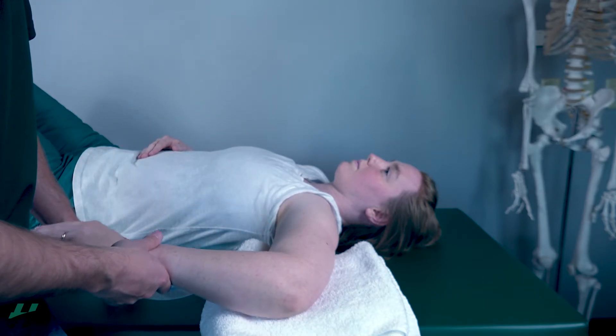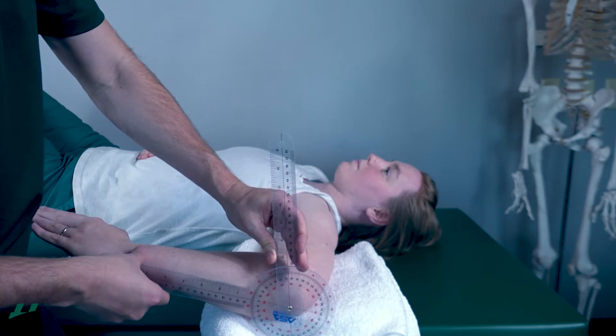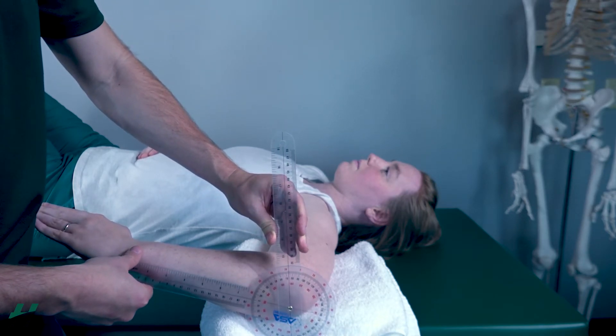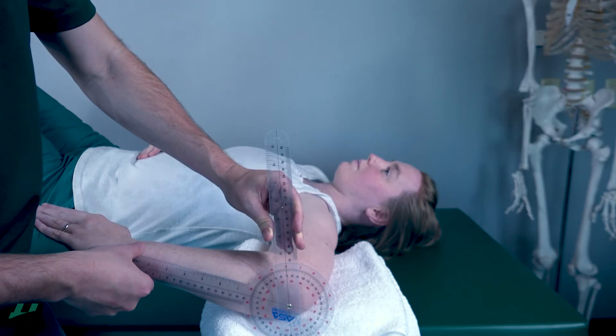So about right there. Axis on the olecranon, styloid process of the ulna, stationary arm perpendicular to the ceiling. We are looking at about 72 degrees of internal rotation.